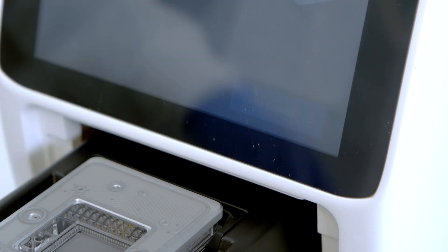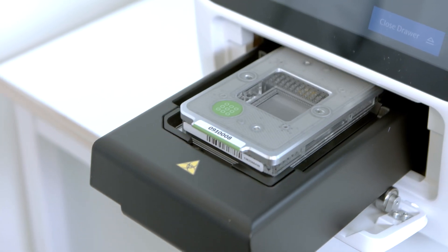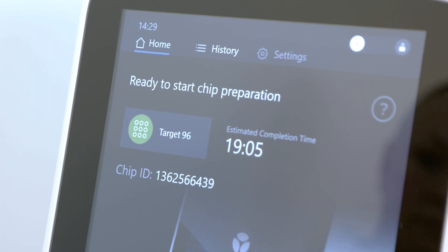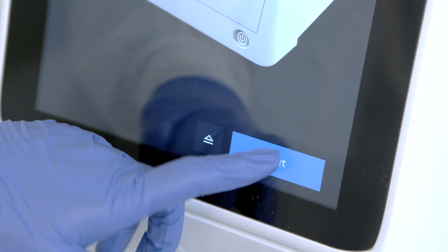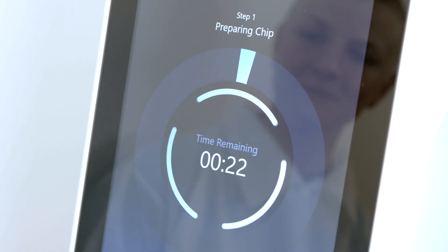Tap close drawer on the screen. The shuttle drawer closes with the ready to start chip preparation screen on display. Click start. Preparation begins and displays the preparing chip screen and the time remaining.